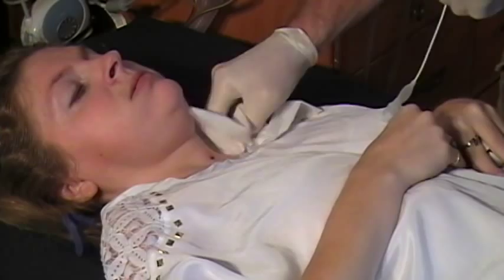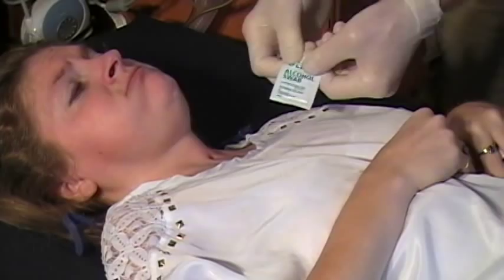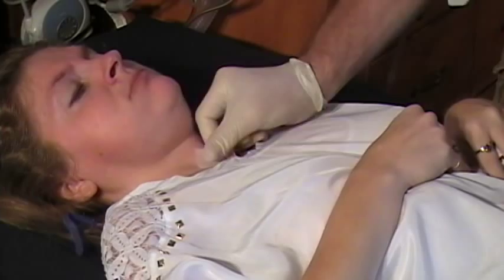And next — this is a killer. You have to be tough for this. I'm sanitizing her stoma with an alcohol swab. I don't recommend that for a new incision — ask your nurse for alternatives for that.